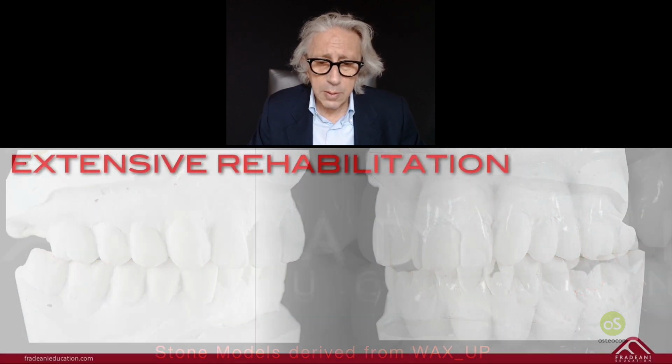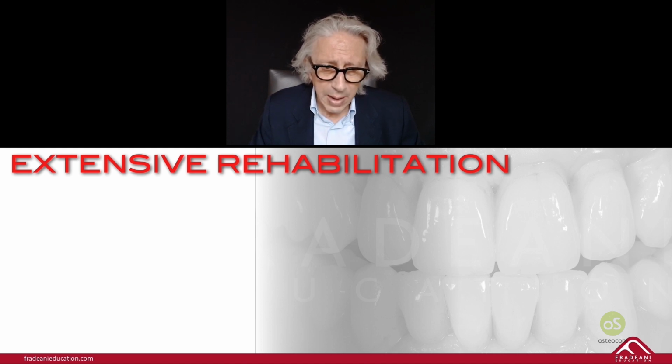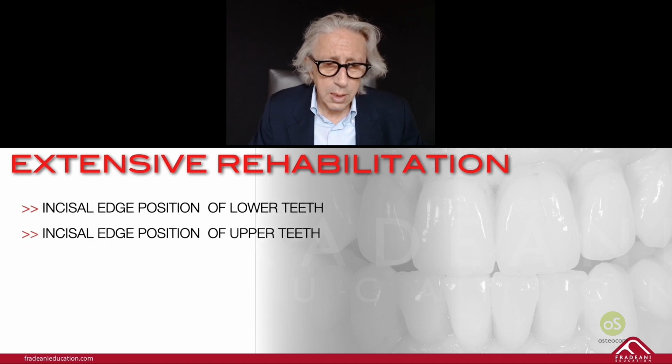And at this point, we have to be really sure that we understood what we have to send to the dental technician. So remember, what they want to know is how much you have to increase the length and the volume of the upper and lower anteriors. That will be the starting point. So achieving the determination of the new incisal edge on the upper and the lower arch. That will be the starting point for sure.